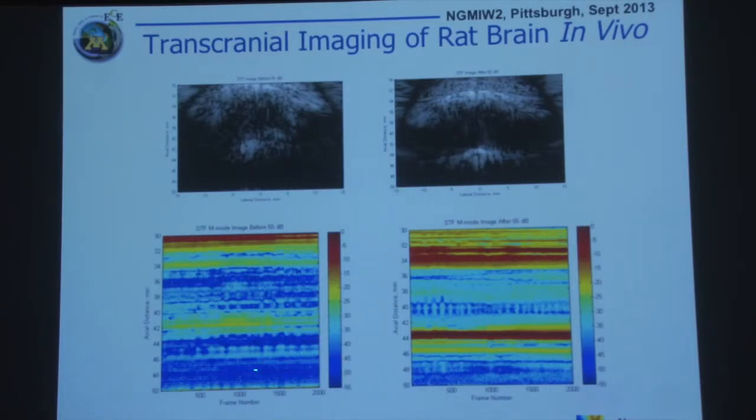Afshin Divani. And even though we're not able to get corresponding cross-sections, I'd like to point your attention to this result, which I find very, very exciting. In this case, there is a blood vessel, no contrast agent, nothing, just pulsation through a blood vessel. Fairly high pulse rate, but it's very evident, very clear. In fact, I think I can argue that the vessel dilates and shrinks. So this is over 2 seconds at 1,000 frames per second.